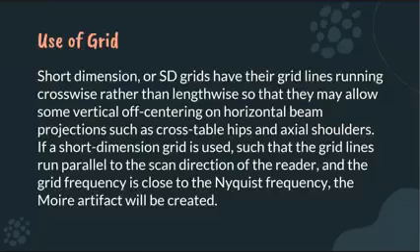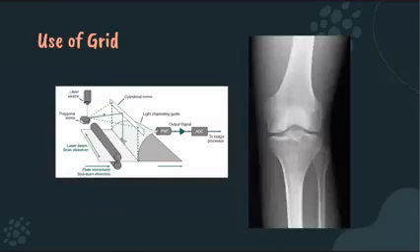As I have told you, in the film screen system, because of the superimposition of two linear grids which have the same frequency, more artifact will be produced. For CR imaging, when the Nyquist frequency overlaps with the frequency of the lead strips within the grid, what is the artifact called? It's called aliasing artifact. As you can see, this is the artifact that will occur. There are grid lines that are produced.